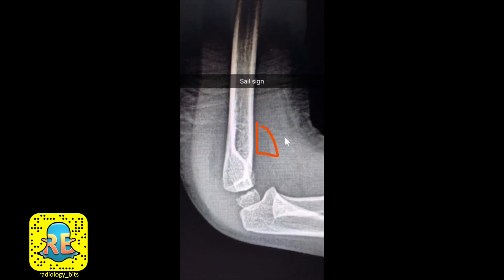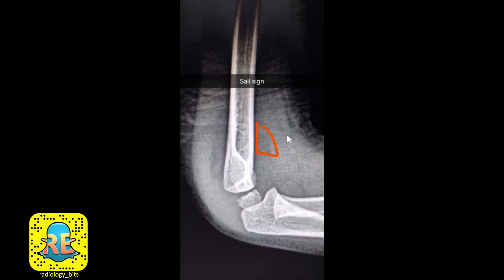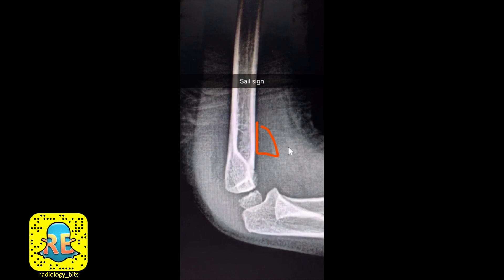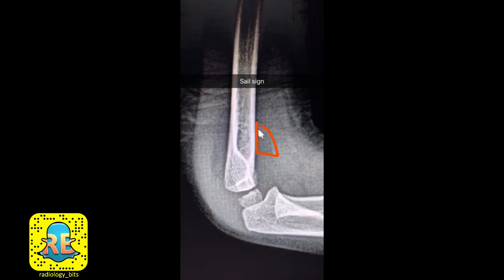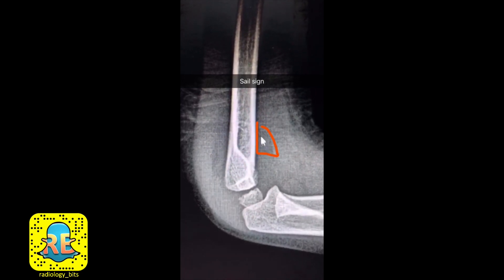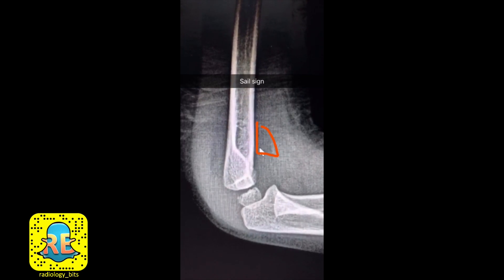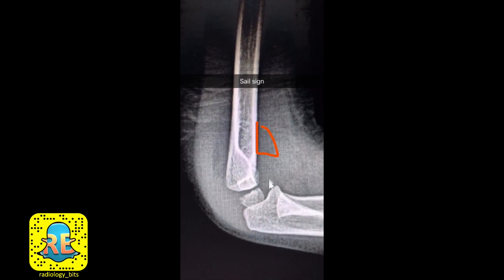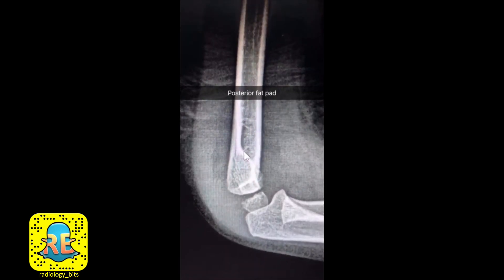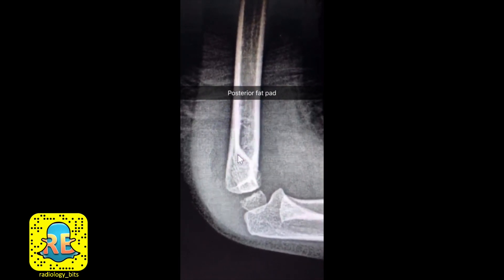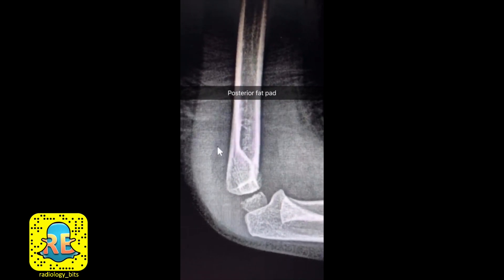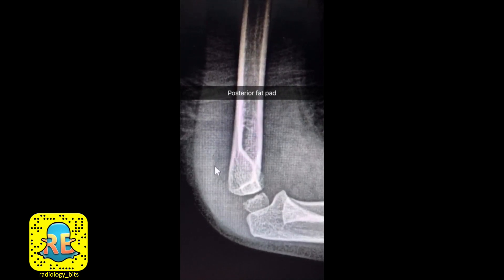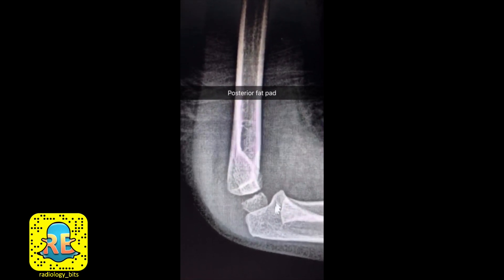Now let's look at the fat pads. Sometimes these are difficult to see and you have to adjust the window, but you can see an area of lucency with a triangular or sail-like appearance — this is the sail sign. The anterior fat pad is displaced anteriorly by fluid within the joint space, indicating joint effusion. Not only that — we agreed you should not see a posterior fat pad at all. If you look carefully, there is an area of lucent fat displaced posteriorly — a positive posterior fat pad — confirming joint effusion.